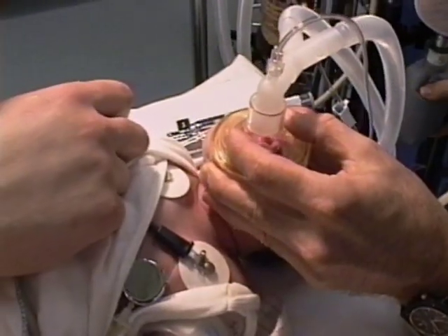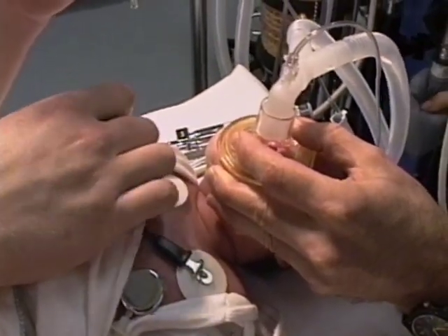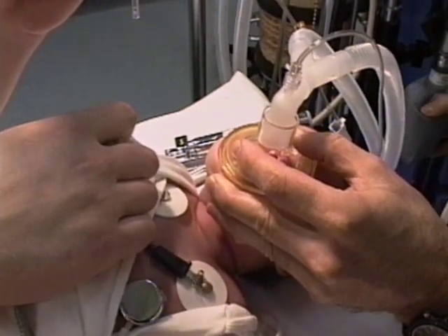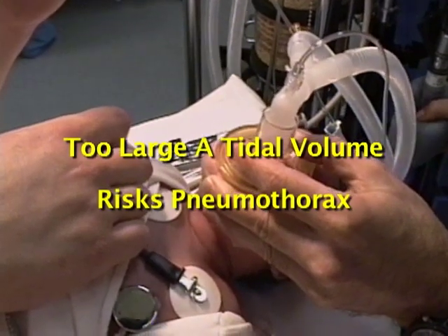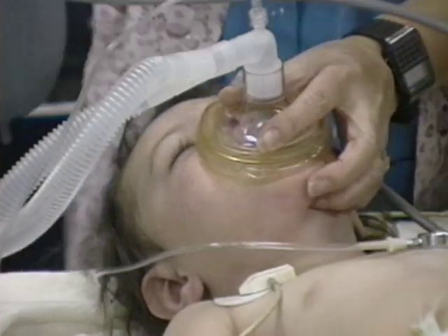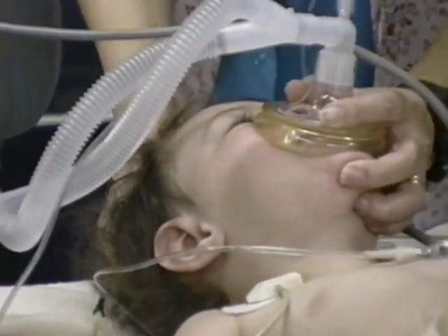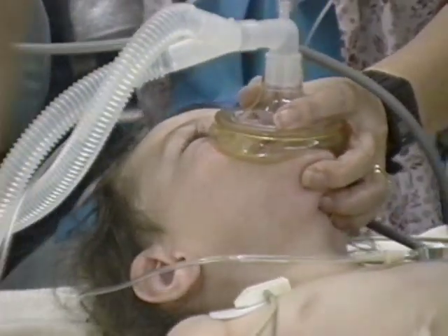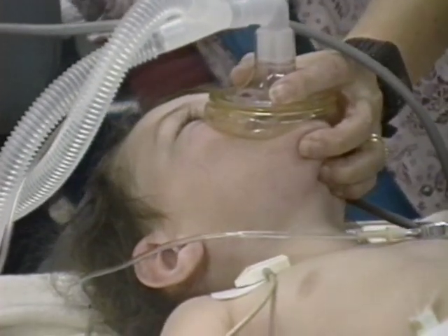Always use the least force required to effectively inflate the lungs. It takes a lot less force to give a 50 milliliter breath as opposed to a 900 milliliter breath. Too large a tidal volume risks pneumothorax, especially with children. Relax the left hand slightly for the few seconds it takes for the bag to refill. Gripping the mask too tightly can cause your hand to cramp. If your fingers spasm, you'll lose fine motor control and have difficulty maintaining a seal.